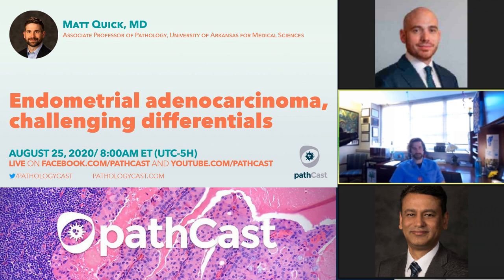And I think that that's kind of the take home there, is that this is just yet another tool in your toolbox for identifying one of these cancers. That being said, you certainly see that mutation in other tumors. And so again, using it in isolation, not a good idea. You want to use that in conjunction with your morphology and with all of the different stains that you're going to use to help whittle down your differential diagnosis. So yeah, it's a good new finding with these tumors, and it could be somewhat helpful. So if your back's up against a wall, try it out and let me know how it works.